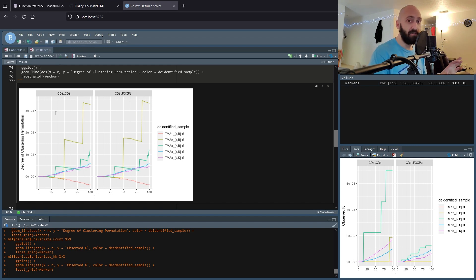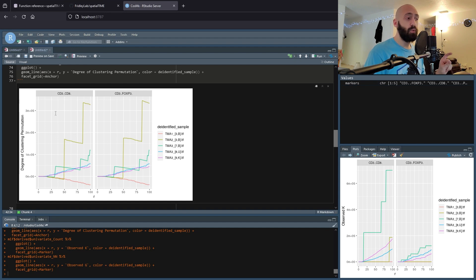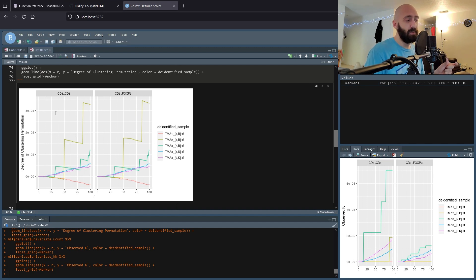For the bivariate version, it's similar. We subset out our CD8 and FoxP3 cells from the point plot — like we looked at in the spatial transcriptomic data — and then from each CD8 positive spot we measure out the chosen radius and count the FoxP3 cells. That's the bivariate approach, and it works the same way for both Ripley's K and nearest neighbor G.